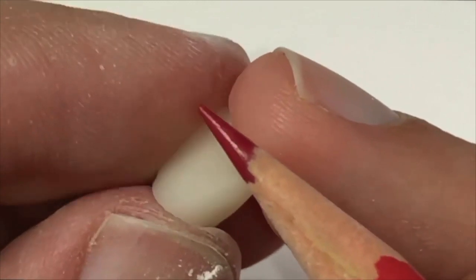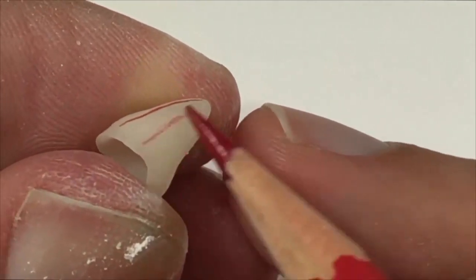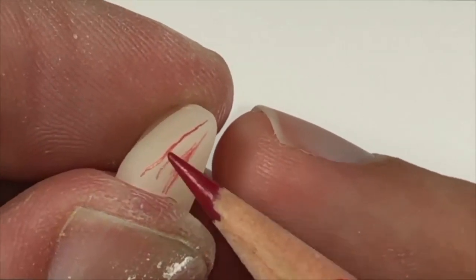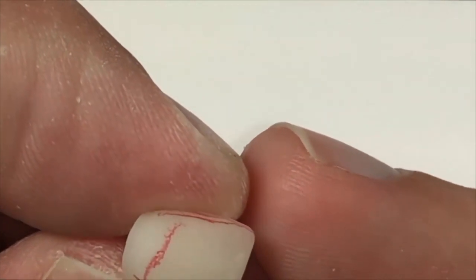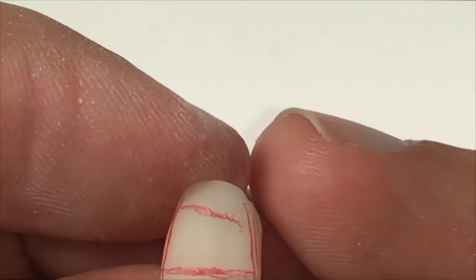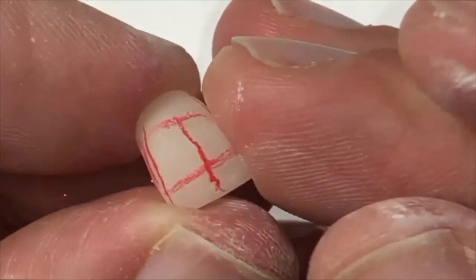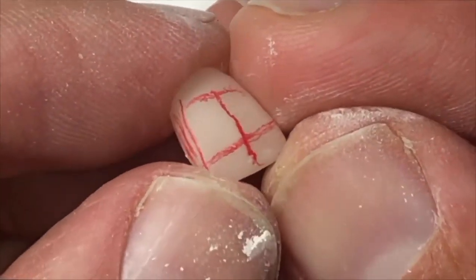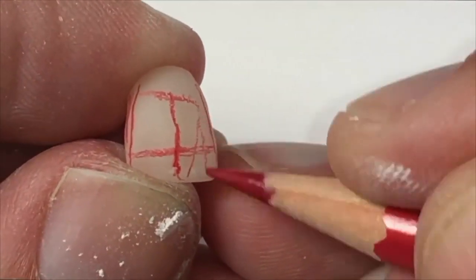First, the line angle and contact points are identified, and the area in between is shaded in where you will grind. Next, the cervical height of contour, the incisal one-third, and the middle lobe are identified. Finally, we draw in the developmental depressions, and a final template has been drawn to guide your contouring.